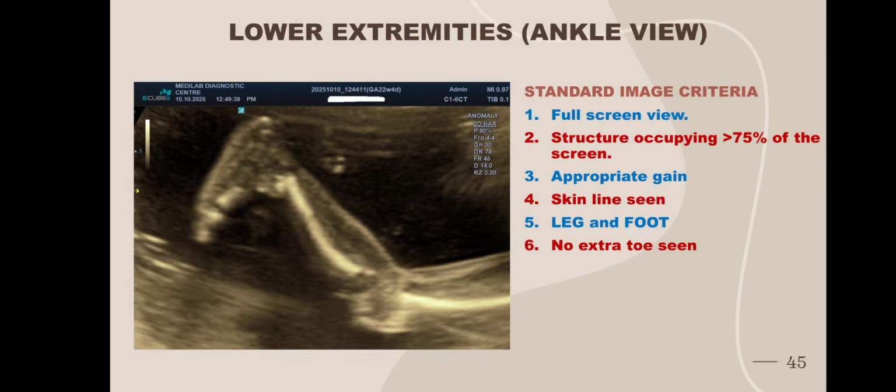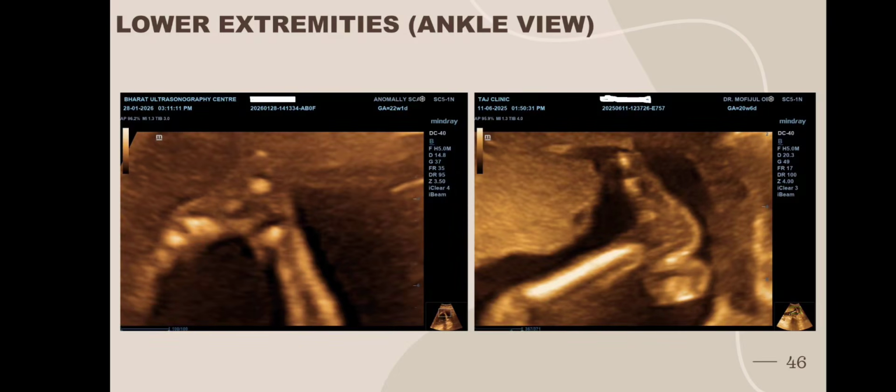See the ankle view, and confirmation of both lower legs should be confirmed. With appropriate gain, skin line seen, leg and foot should be visualized. No extra toes should be visualized. This is ankle view. More images of ankle views.